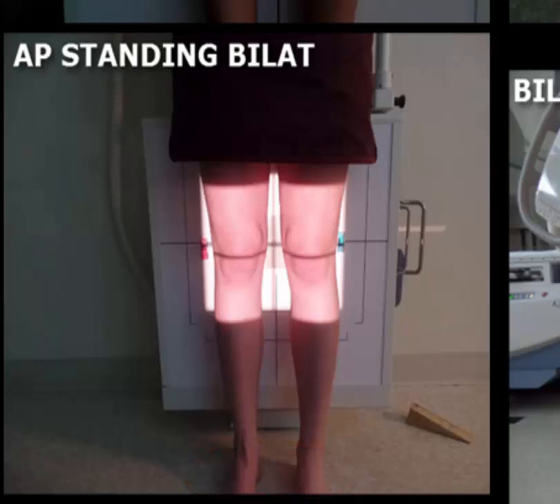Once they've done so, place the patient up against the upright bucky. Ensure that their legs are close to the upright bucky, but more importantly, we want the patient to be standing there stable, as well as having their feet placed forward, placing the knees in a true AP position. Center the central ray approximately 1/2 inch distal to the apex of the patellas. Also, ensure that you have both right and left markers. When performing AP bilateral knees upright, you may collimate from side to side, open from top to bottom.